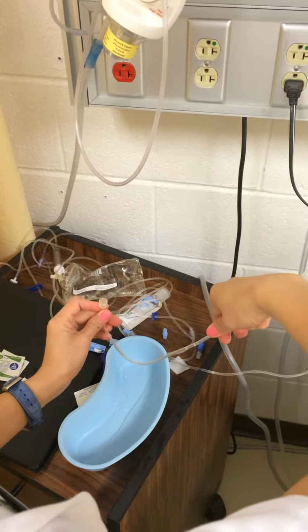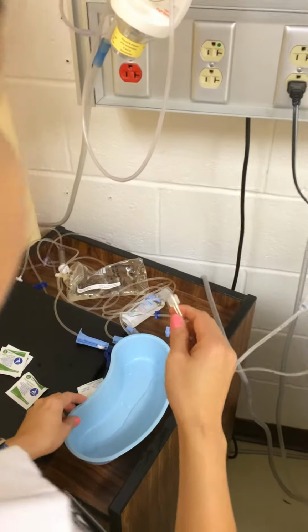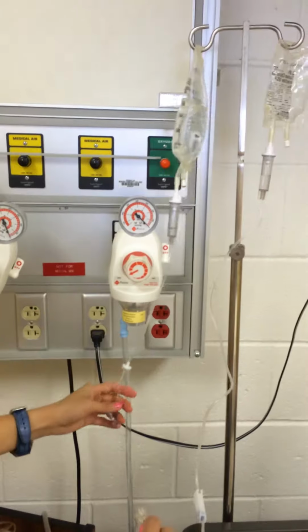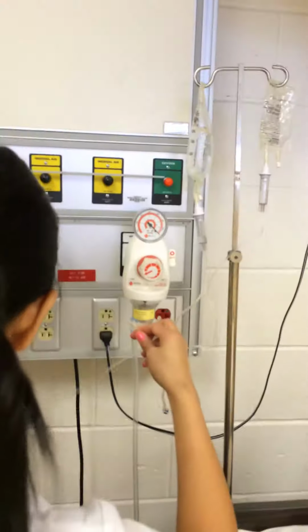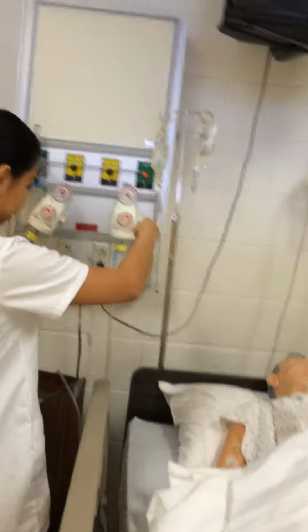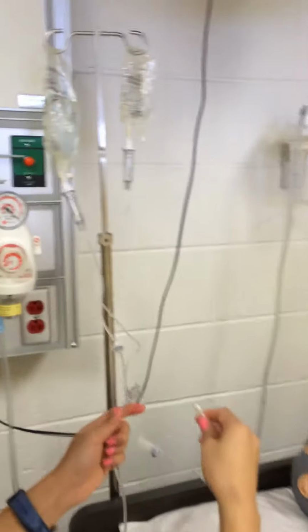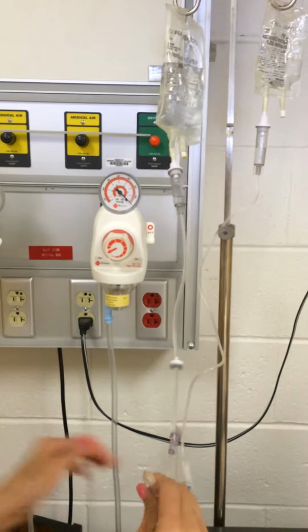Okay. I already primed the tube, and I am going to attach it to the primary IV solution. And then I'm going to wipe it with alcohol. Okay.